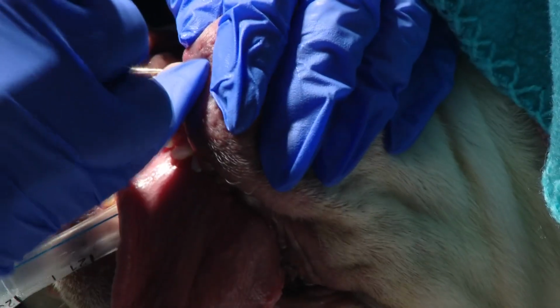With traditional X-ray, we were getting 10 to 20 X-rays that take us anywhere from 5 to 20 minutes to get, depending on how big the patient is. And we're only getting two-dimensional imaging, and we're going through a lot of bone in that image. Whereas with this, we're getting 0.3 millimeter slices, 600 X-rays in 20 seconds. So that's a ton more data, a ton more information, not only on the teeth, but also we can look at the nasal cavity, the ears.